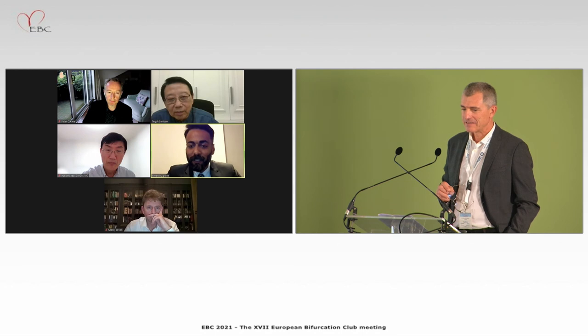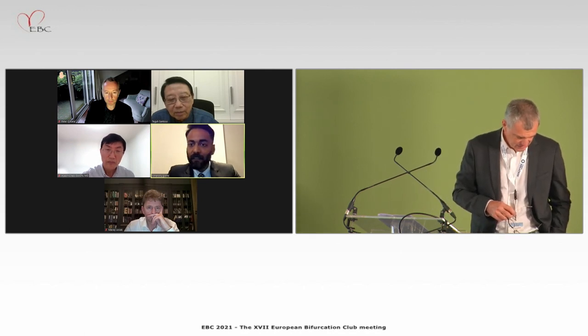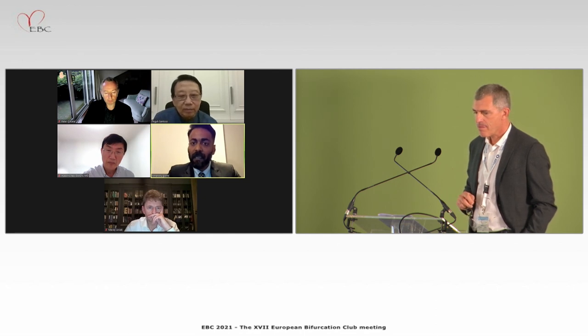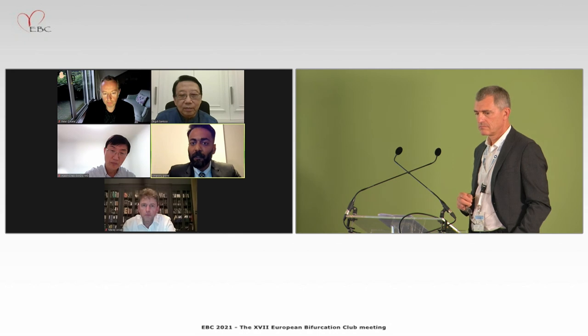Thank you so much for the nice comments and question. Actually, the generation of IVL balloon that we have in India is the previous generation, the one which was not used in the DISRUPT-3 trial. So we have a single membrane IVL balloon, which is more prone to rupture. And we think that the last pulses of the IVL balloon are always a problem, that it can rupture in the last pulses. But in this case, the distal left main had a very heavy calcified nodule, which in the direction of the LAD we had prepared with a rotablator because it had a favorable wire bias towards the LAD. But we did not do rotablator into the circumflex. So I'm not sure whether the IVL balloon ruptured due to the thin balloon structure or due to the calcified nodule at that location. And for precisely this reason, we believe that if there is no upfront imaging, we should probably avoid using IVL balloons in nodular calcium to prevent similar complications.